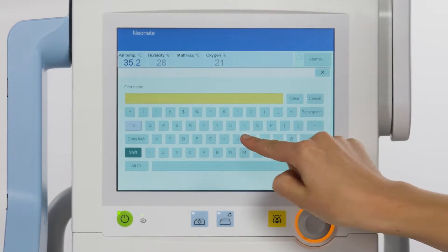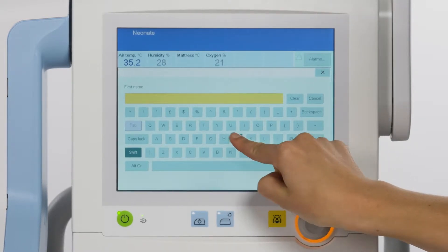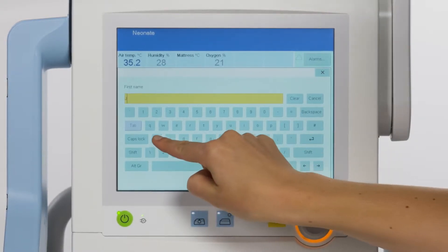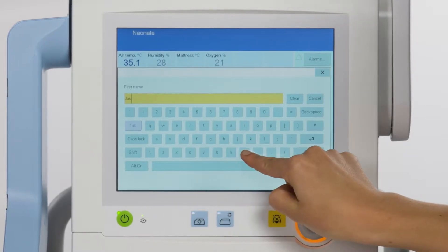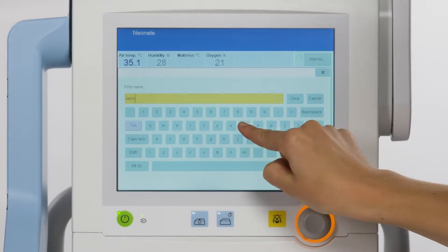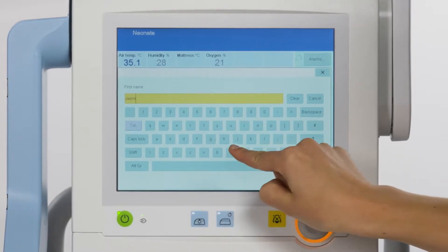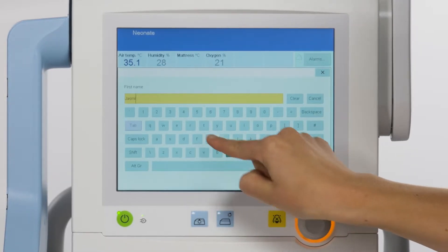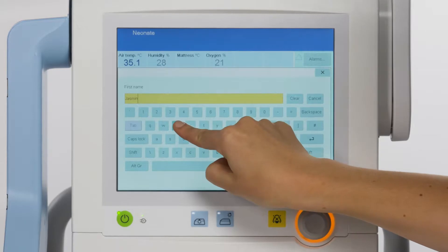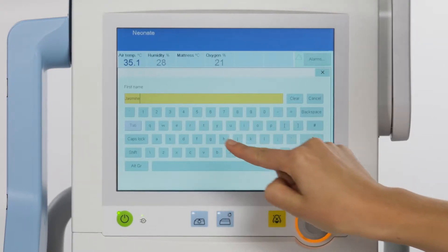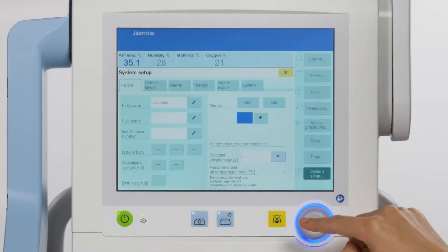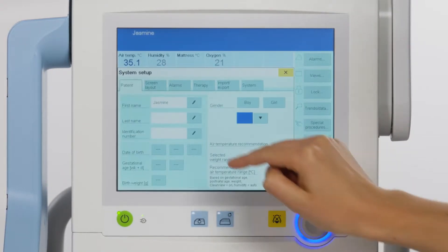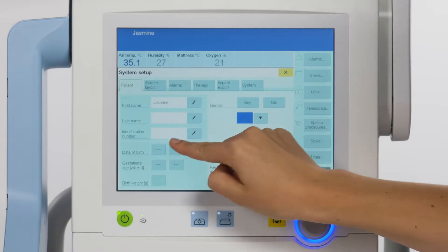You can enter the following data using the keyboard: first and last name, and also the identification number. Note, the identification number will overwrite the patient name, so when an ID is entered, only the ID is displayed.